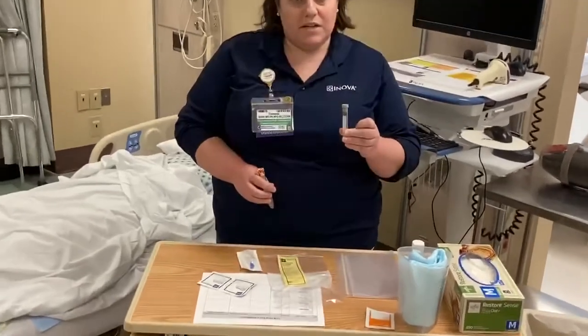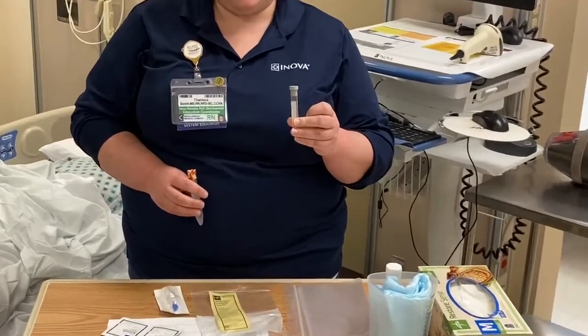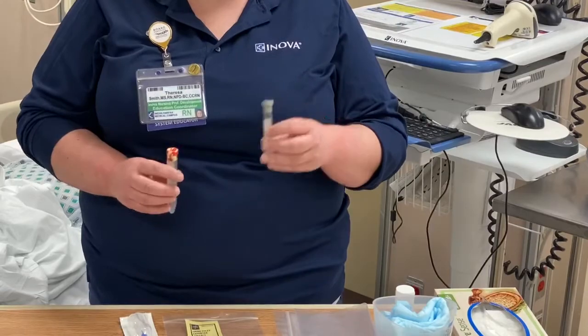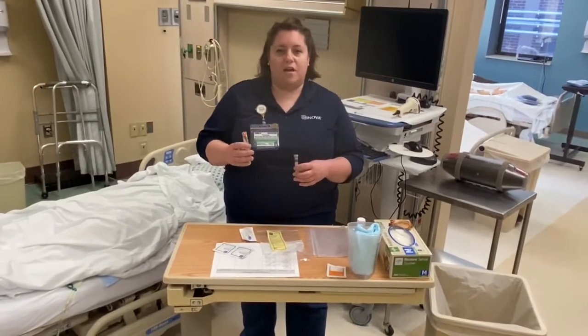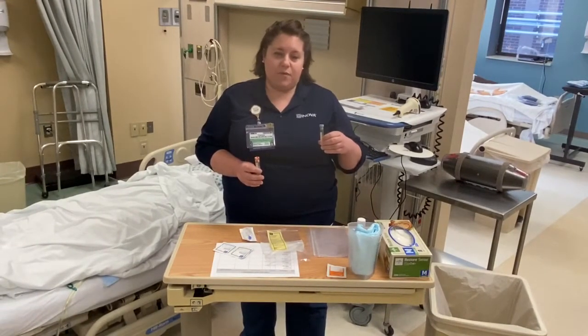And this tube tells the physician the specific type of bacteria that's present in the urine so they can order the appropriate antibiotics. So normally that process would be you gather one sample, it goes to the lab, it takes a little while, it comes back as positive. So a few hours later, you have to go in and get a second sample.